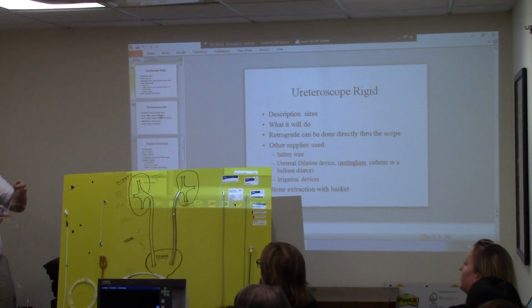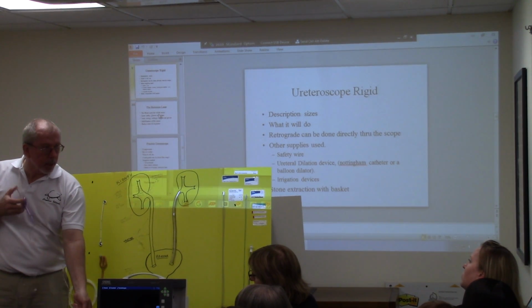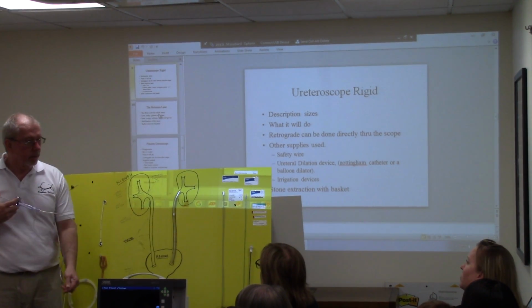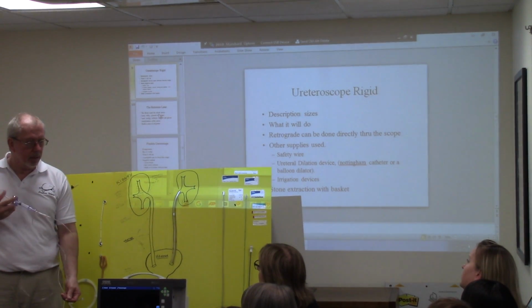So now, this will connect in line. This connects into the water bag. And then they'll have a constant flow of water. And then this will connect to the ureteroscope. And just like the Pathfinder, every time they want to give a little bit of pressure to where they're looking, they just do it, another manual technique. But this is the single action pumping device. Okay.